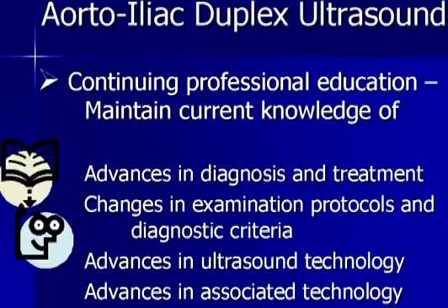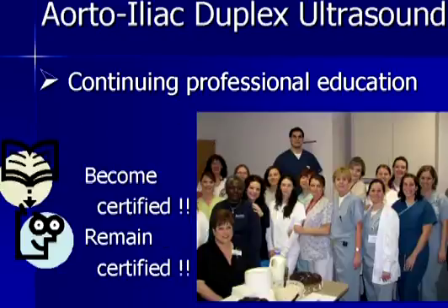Finally, I cannot emphasize enough your continuing professional education to stay current in the field. You need to maintain current in your knowledge of what are the diagnoses and treatments for these diseases. Have standardized examination protocols changed out there, and do our laboratory protocols meet these standards, and do we use appropriate diagnostic criteria? You want to stay on top of advances in ultrasound technology and be able to utilize these new technologies to their best effect in the examinations that you perform, and as well any associated technologies such as might be present within the hospital PAC system that you can utilize to your own advantage.